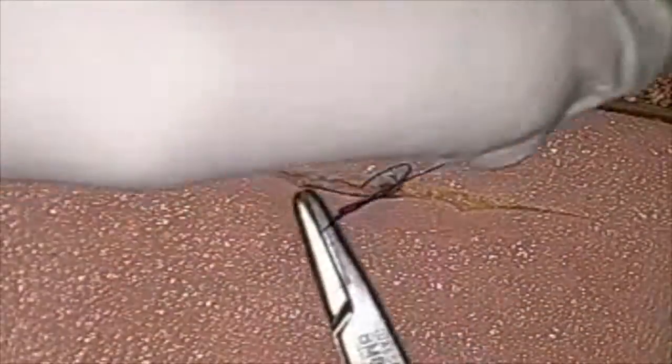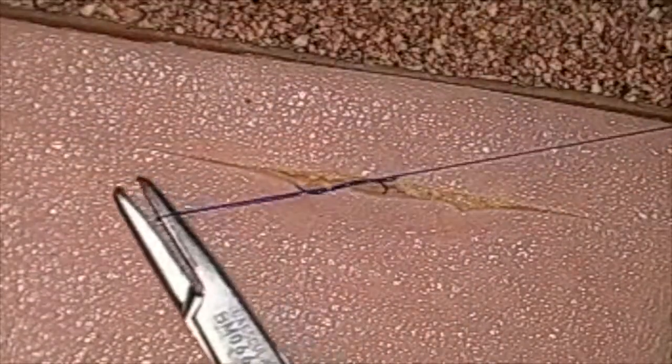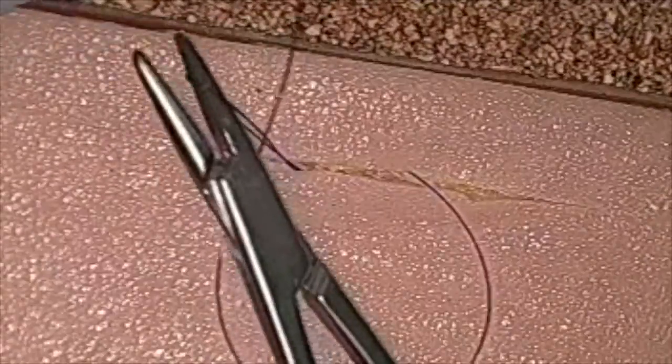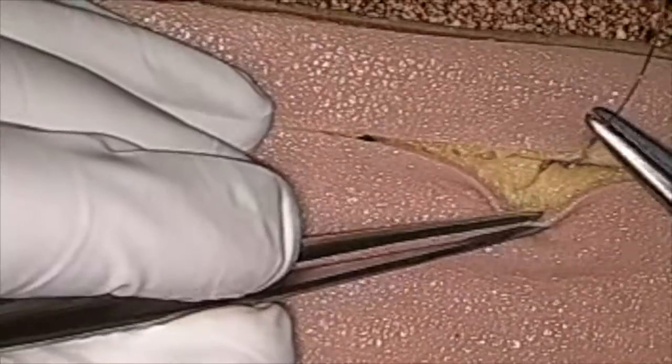There's our loop to single strand, and we're going to finish with seven throws total. Once you're finished, you can have your assistant or yourself cut the knot short. You can see here that's buried nicely.